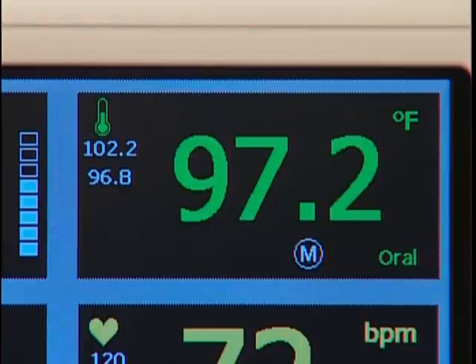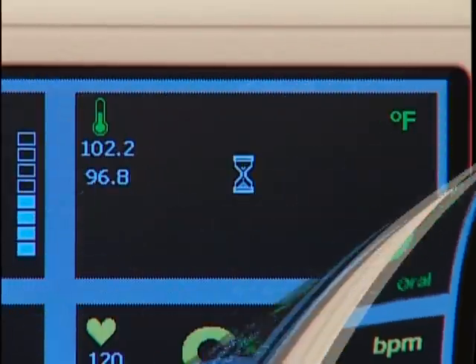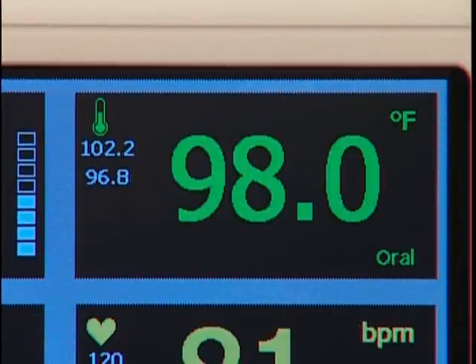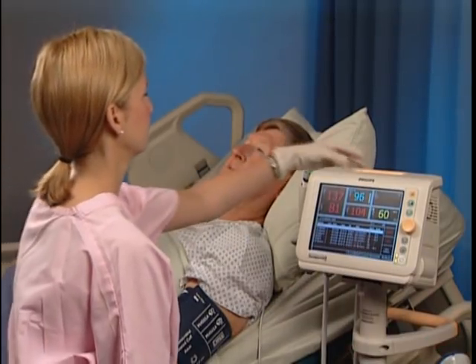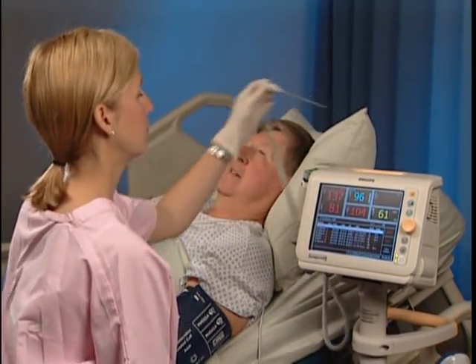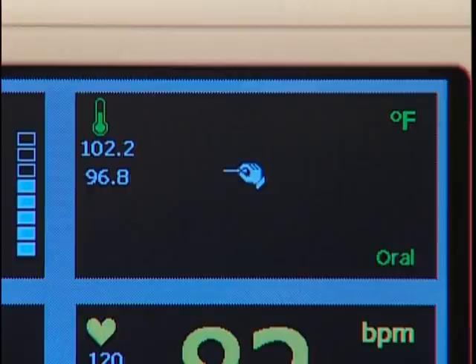There are two modes for temperature measurement: monitored mode, which provides a continuous measurement, and predictive mode, which takes a single measurement. In predictive mode, after removing the probe from its holder, an icon appears and a tone sounds, indicating the probe is ready for placement.